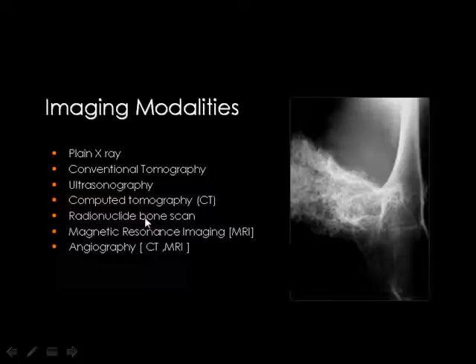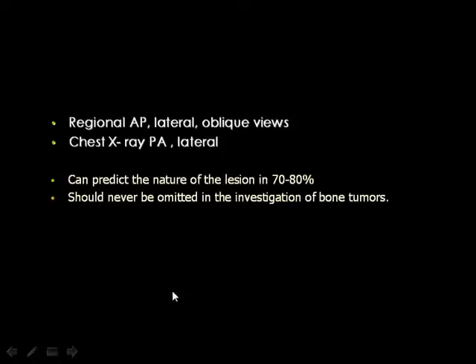These are the imaging modalities used for assessment of the bone tumors, including the very important one, which is the plain X-ray. And we may still use the conventional tomography, which is largely replaced by CT, ultrasound and bone scan, as well as the MRI and the angiographic techniques.